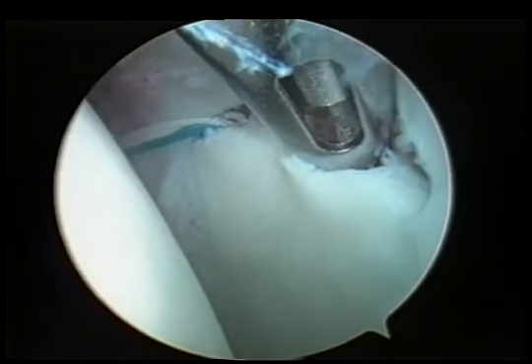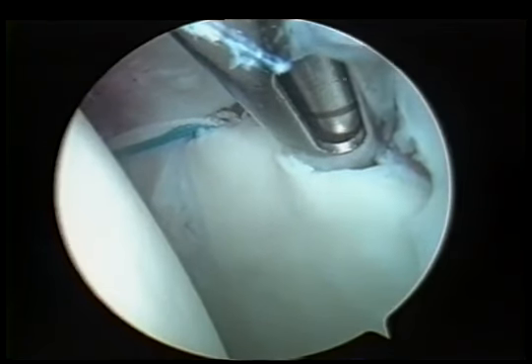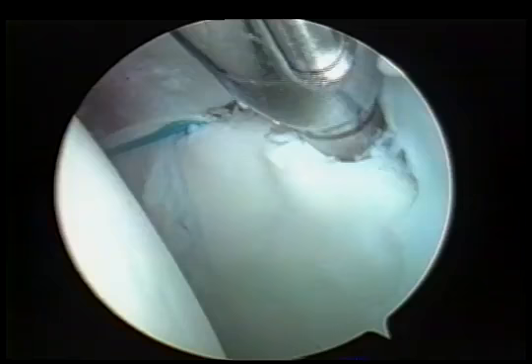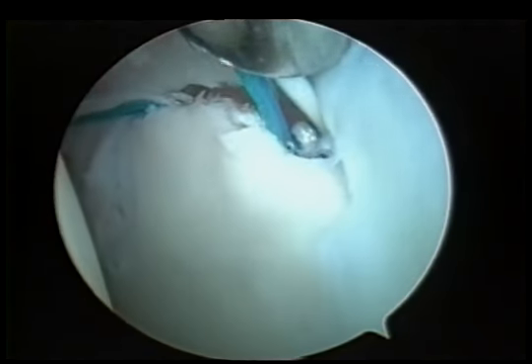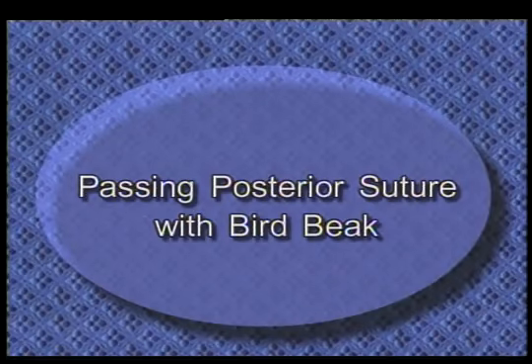You want to be sure that the threads are catching, and because of the taper of the anchor, sometimes it doesn't catch until you reach a point about halfway down the threads, and so you have to be pushing on your inserter as you go to be sure the threads are engaging. You'll seat this down to the top of the laser mark, and now remove the inserter, and we have two doubly loaded anchors.